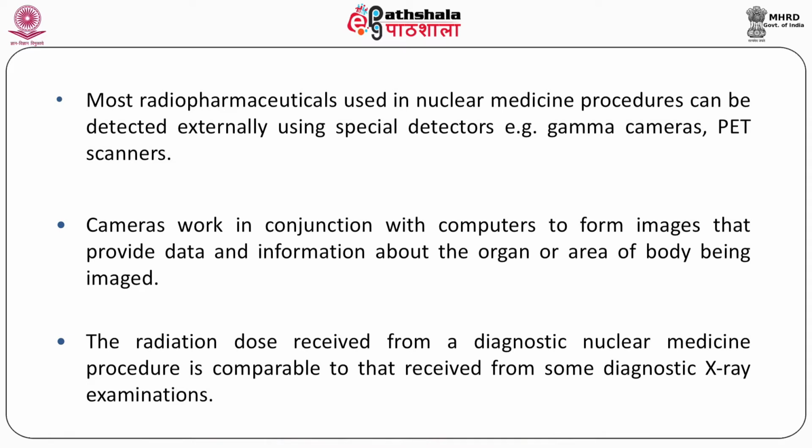I keep on emphasizing those important things. One is the radiopharmaceutical and the other is the devices. If the device is good and the radiopharmaceutical is good, you can diagnose the disease at a very early stage. Cameras work in conjunction with computers to form images that provide data and information about the organ or area of the body being imaged, and finally based on this, doctors can make a regime to treat the disease.